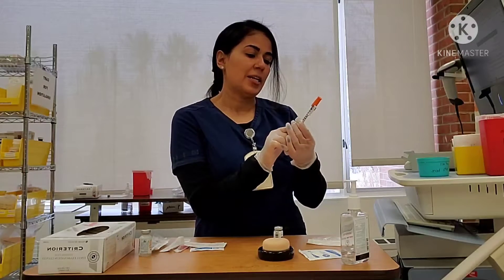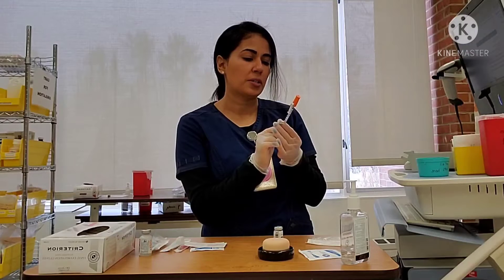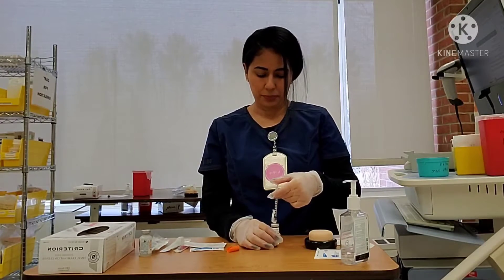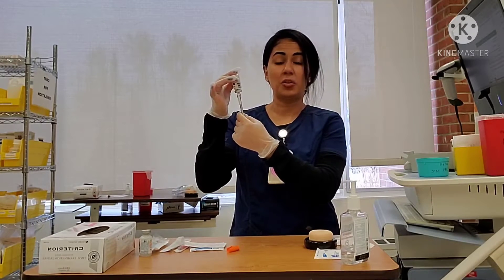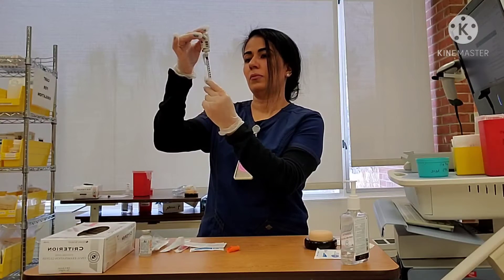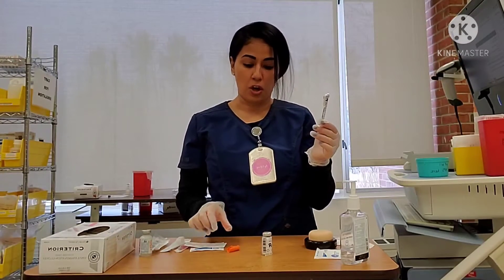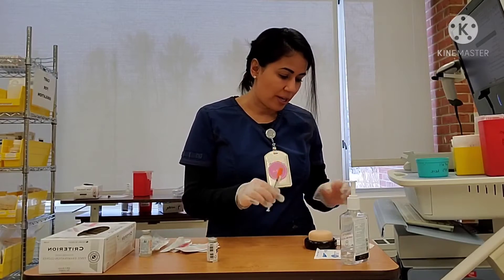I know I want to administer four units, so I'm going to bring the plunger down to four units. I'm going to put the needle into the vial and inject my four units of air. Then I'm going to invert my vial. Be careful because the 29 gauge needle is very fragile and can bend easily. I'll hold it at eye level and withdraw my four units. In some facilities, you will need a second nurse to witness this to confirm the correct dosage. Then I'll scoop up my cap and I'm ready to go to my patient's room.